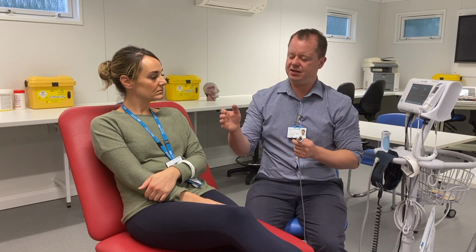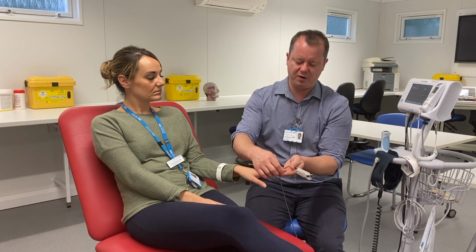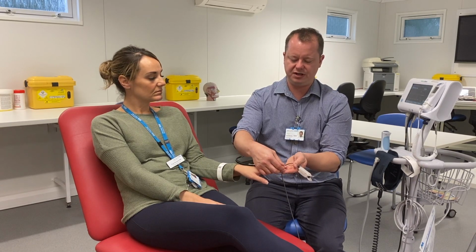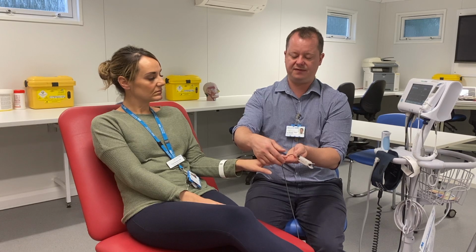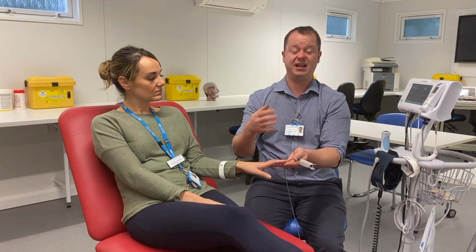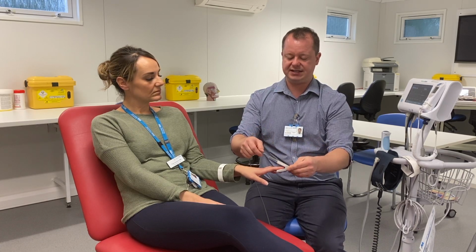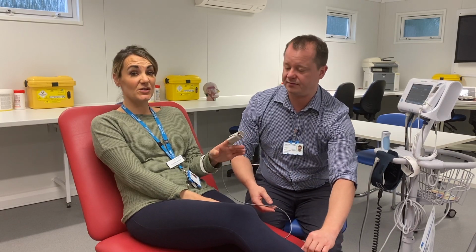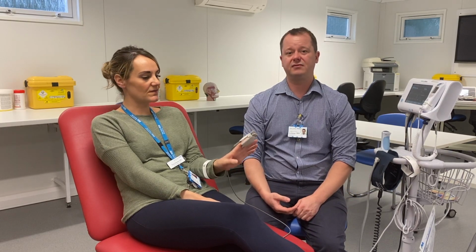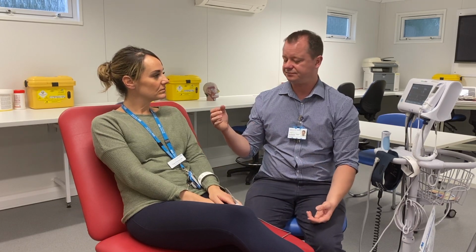We want to be able to put it on the patient's finger. If we are going to do that, we need to make sure that the fingers are warm and well perfused. Before you record it, you can squeeze the finger very gently for 5 seconds at the height of the heart, and then see if the colour returns to the finger within 2 seconds. If that happens, then you know the patient's well perfused, and then you can place the SATS probe onto the finger. Along the same lines there, Tom, if someone's wearing nail varnish, or big acrylic nails, that can affect the results. It really, really can. So sometimes you might need to remove that nail varnish.